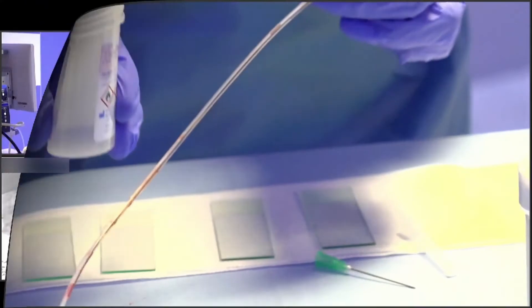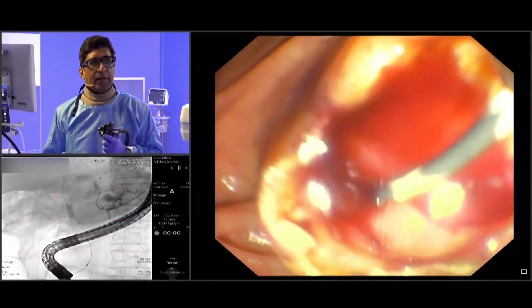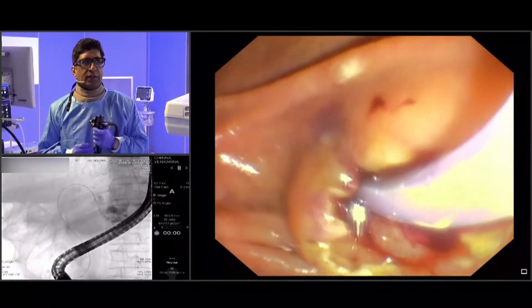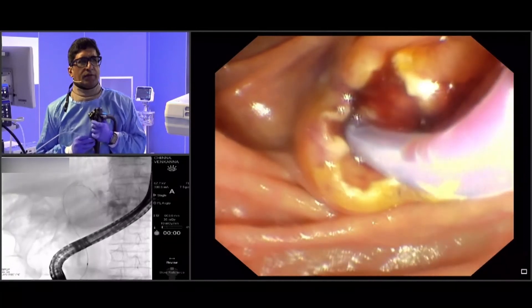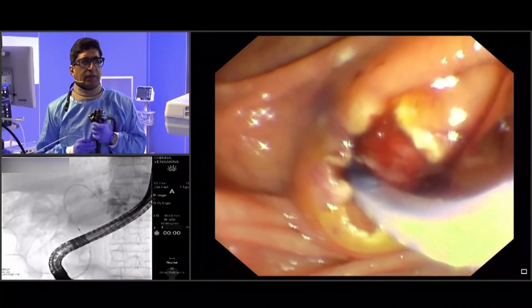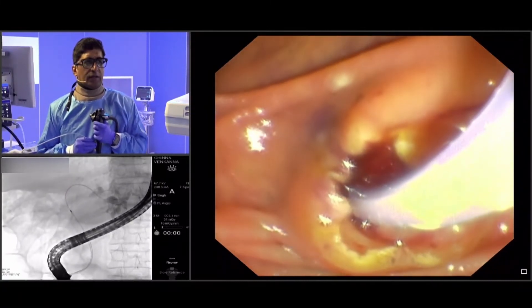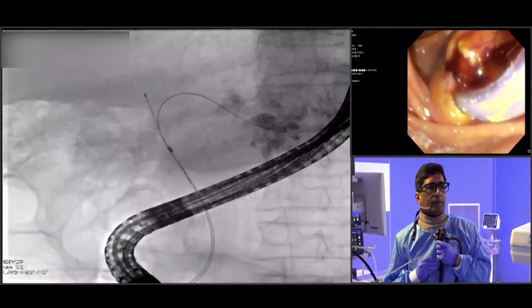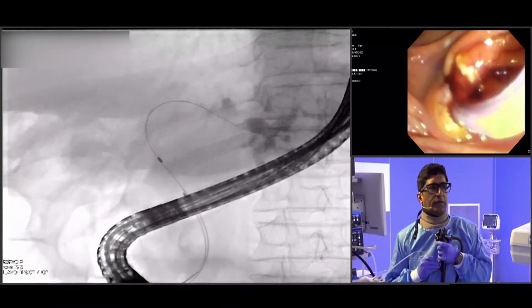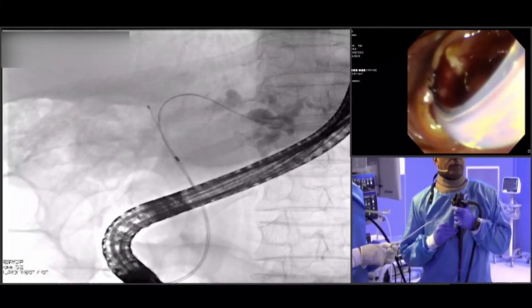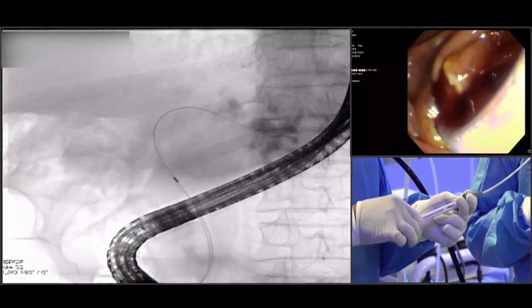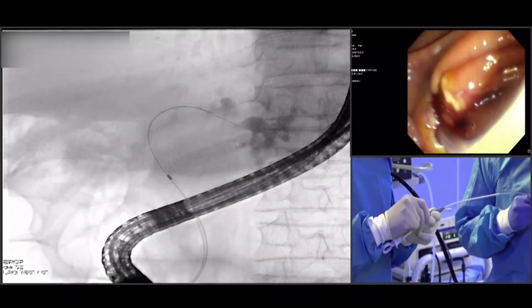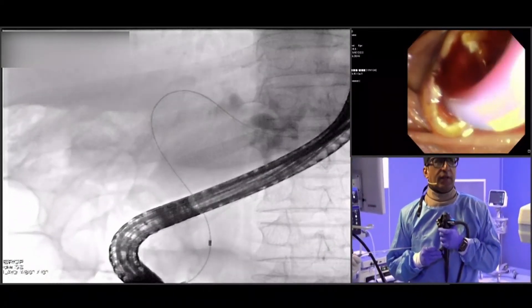We then proceed to the second pass using the same technique. As you can see, passability is very smooth once adequate sphincterotomy has been done — the brush can be passed easily. The marker should be at the distal end of the stricture, and then we do the brushing again. Once adequate brushing is complete, we bring the brush into the sheath and remove it.